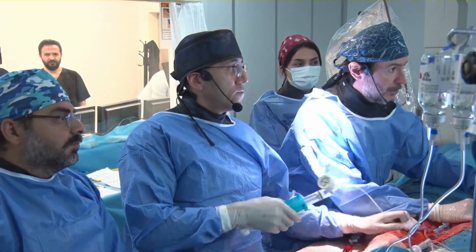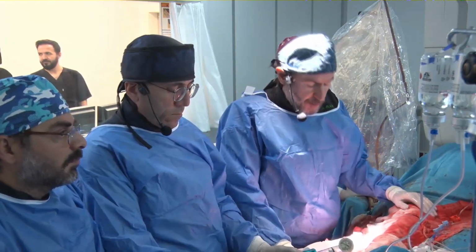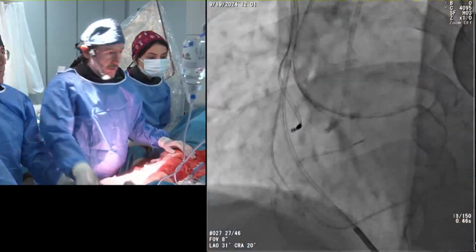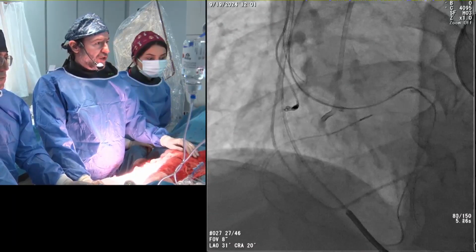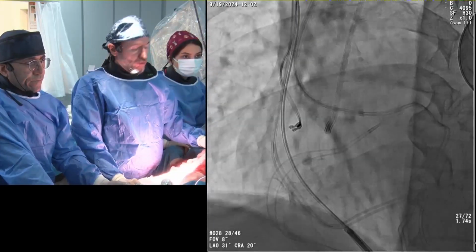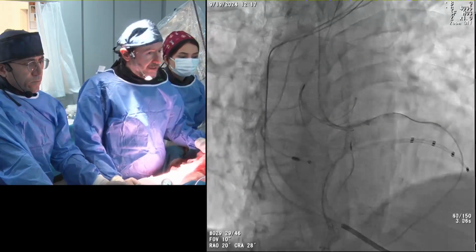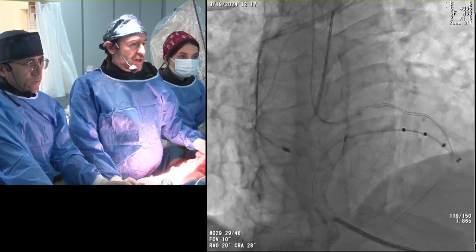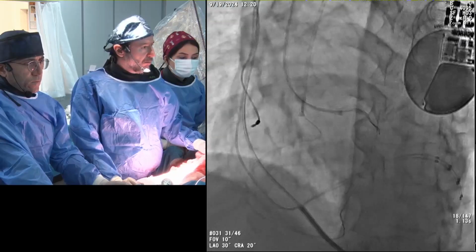Okay, we are finished, but there are some remarks I would like to express here. Haldun's advice was good. We lost our position with the RG3, so then we had to snare again. This time I used an R350. I took it from my Magic Bag. It helped us a lot because it didn't have the friction, and it was easy to snare because it was free inside the microcatheter.